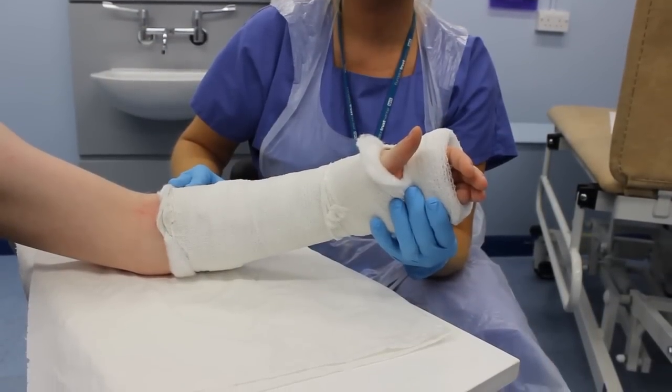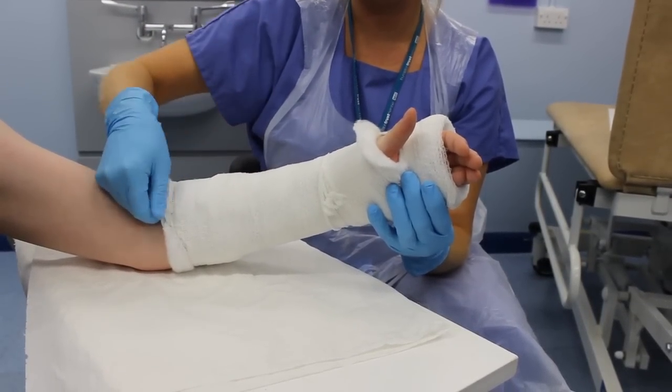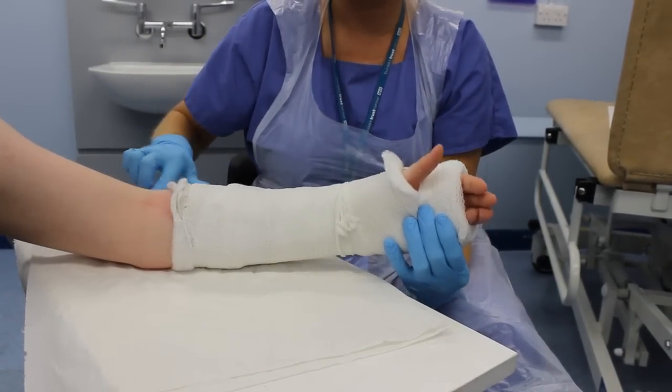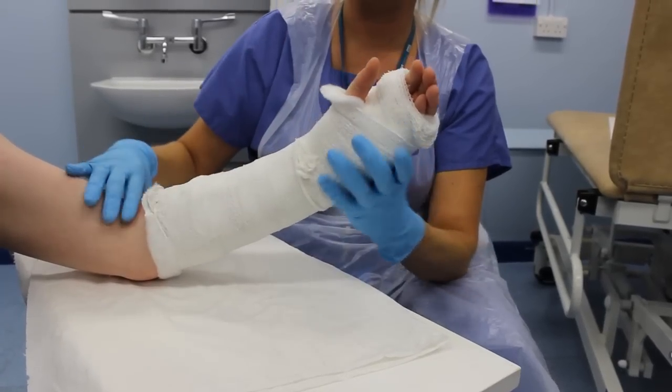Check that the cast is well padded at both ends and no sharp edges can be felt which may cause sores. This cast is over-padded and may be loose, also creating sores.